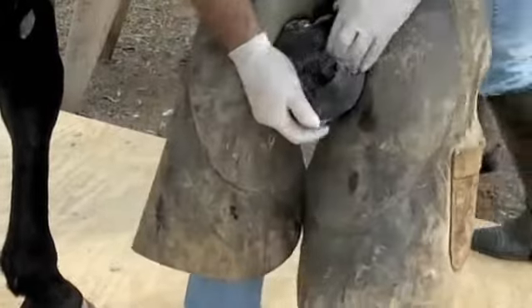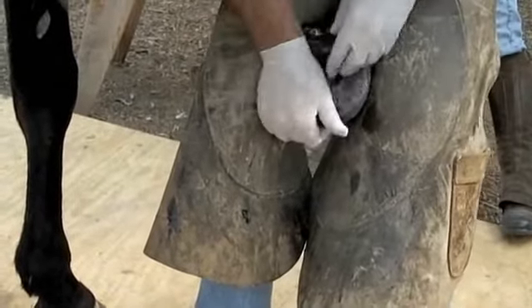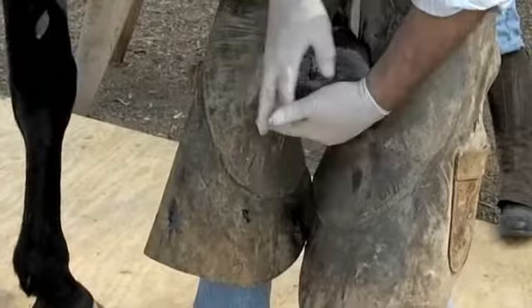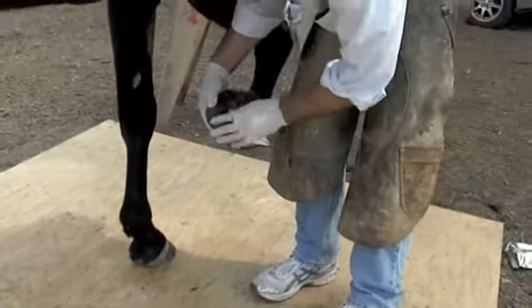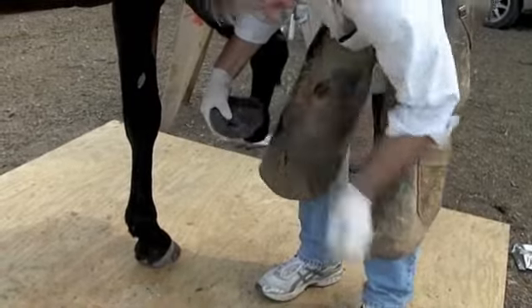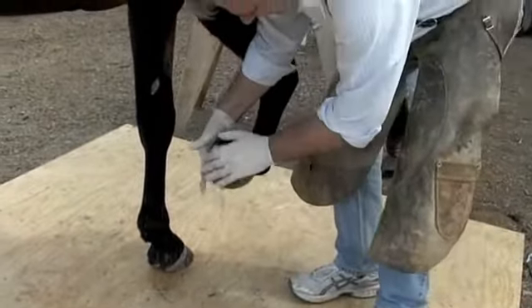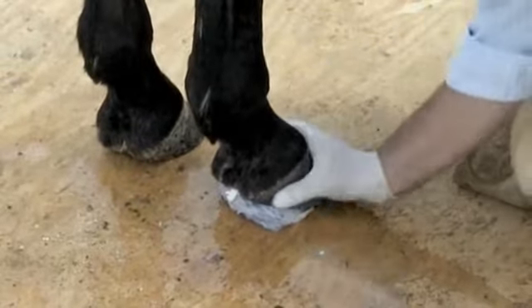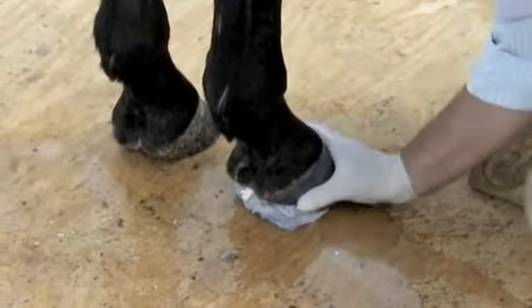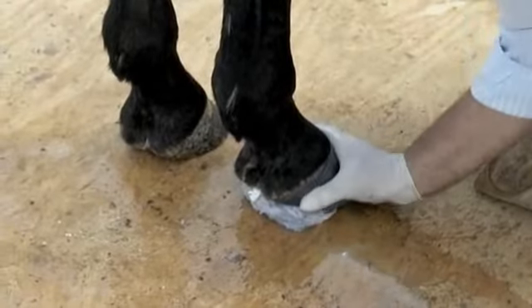Once you've got the cast trimmed, you can fold it and apply it on a wet rag, or use your shrink wrap and go around it 8 or 10 times and set it down. If you're using shrink wrap, go around it 8 or 10 times and then just pour some water around the coronary band and it'll drip down inside the shrink wrap.